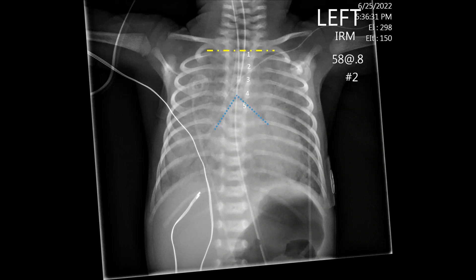With the superior endplate of T1 and inferior endplate of T4 as reference lines, we can see that our endotracheal tube is just above T4. Maybe it's a little low, but it is still above the carina, and I think it would be in an acceptable position as long as the ventilation settings don't indicate something is abnormal.